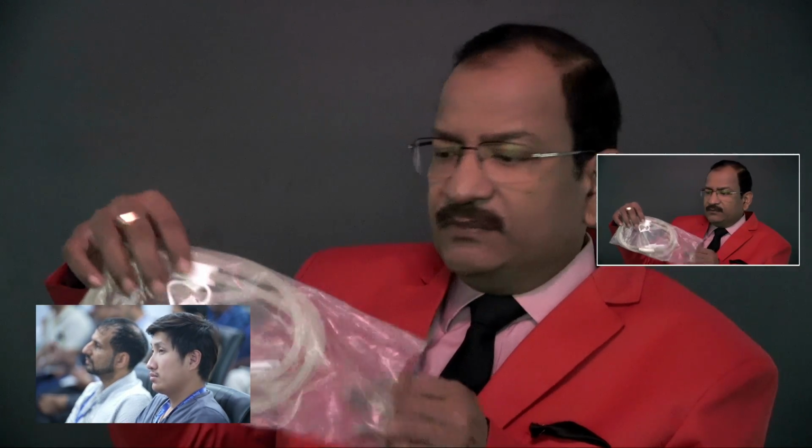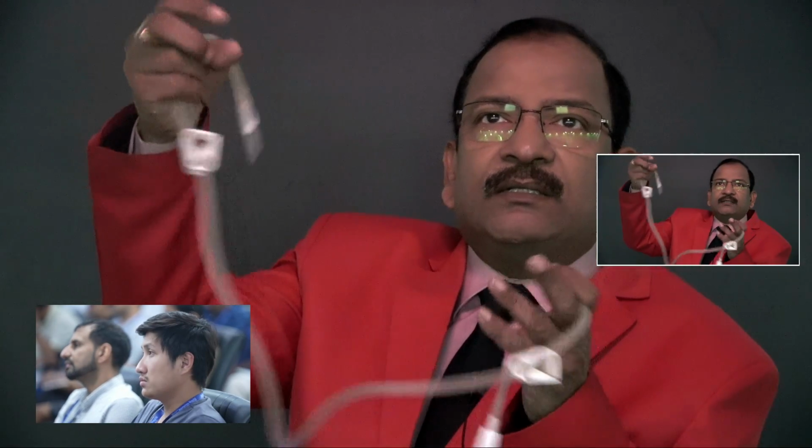And this is called Y channel. In this Y channel, you have 2 channels. See here, it has 2 channels. That is why it is called Y. One will go in one bottle, another will go in another bottle. And there is a lock here.